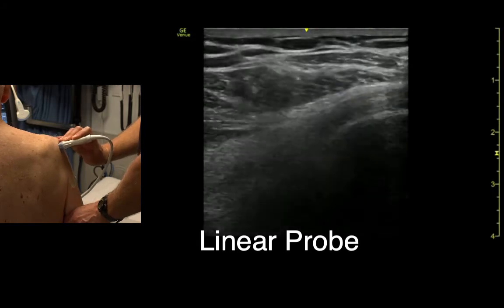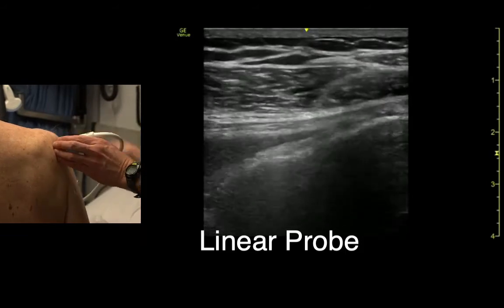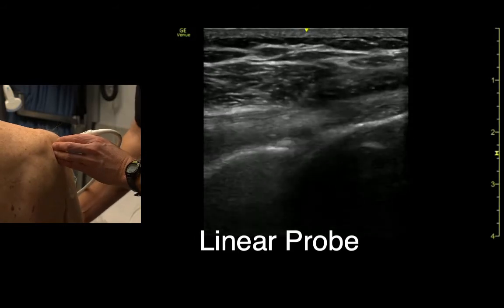It's hard to appreciate the entire joint though with this probe, I think. With a little care we can.